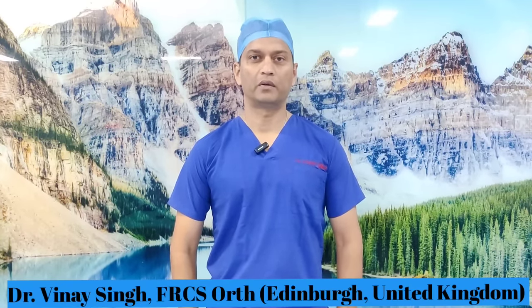Hello viewers. Today I am going to show you a surgical procedure in which we are going to do K-wire of Colles' fracture. Colles' fracture is one of the most common fractures encountered in orthopedic practice. A lot of times it is treated with plaster, but there are occasions where it needs wire or sometimes plates as well. Today my goal is to take you through in a step-by-step fashion to show you how to do a Colles' fracture reduction and K-wire fixation.